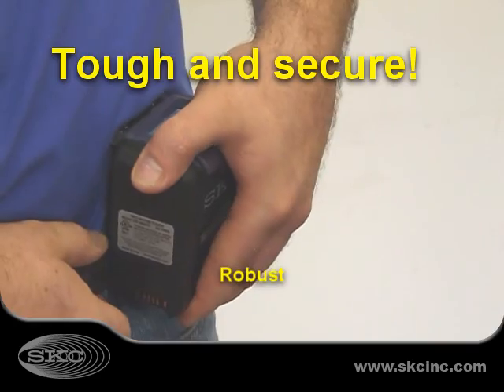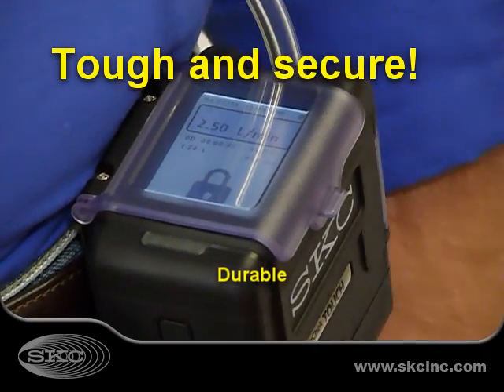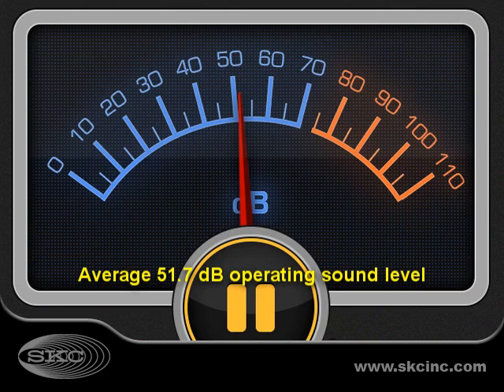AirCheck Touch features a large secure belt clip, protective screen cover, screen lockout features to prevent changes to pump settings, and a unique noise-dampening case for unbelievably quiet operation.